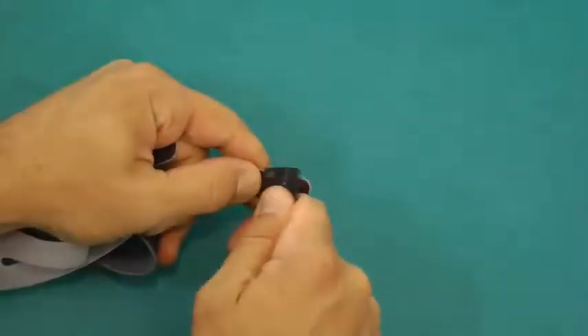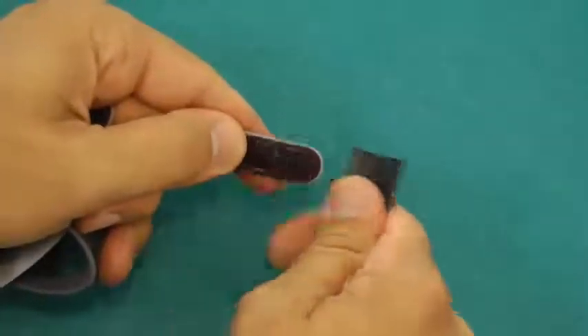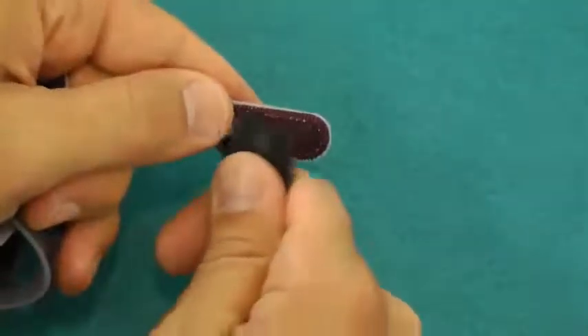To maximize the life of the straps, clean any lint or debris out of the hook portion of the strap with a very fine hairbrush or another piece of hook closure.